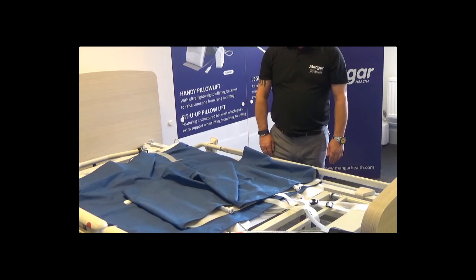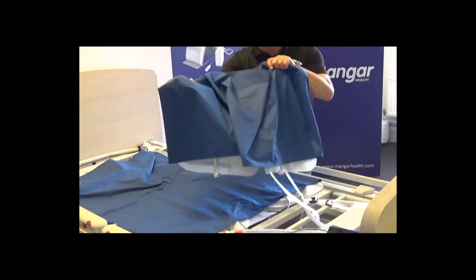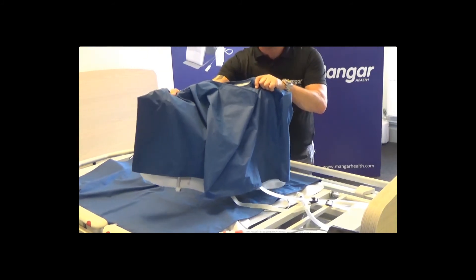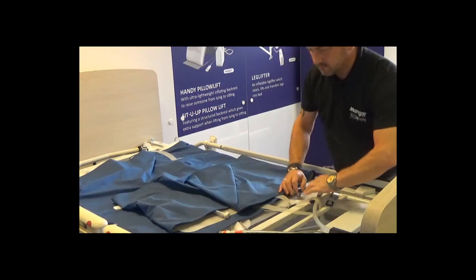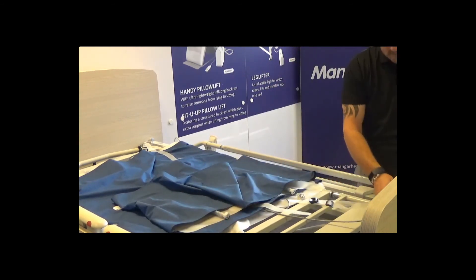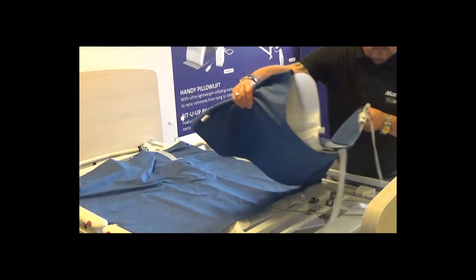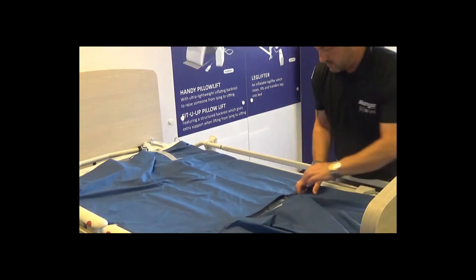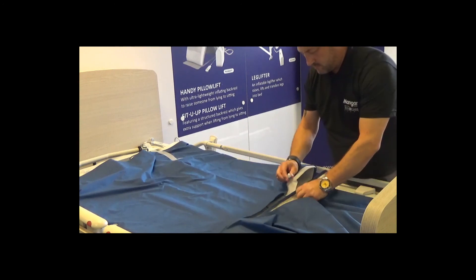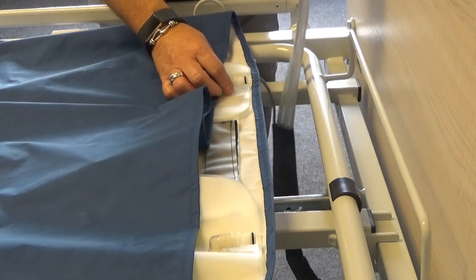For some patients, clinicians may prefer to use the leg extension with the standard Ecomove air chamber system. To add the leg extension, firstly disconnect the air tubes from the air chamber system. Use the connectors on the top end of the leg extension kit to attach to the air chamber system, then reconnect the air tubes to the bottom of the leg extension kit. Always ensure the left and right air tubes are connected correctly.